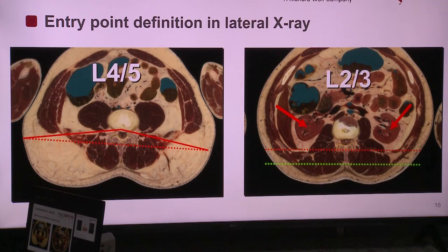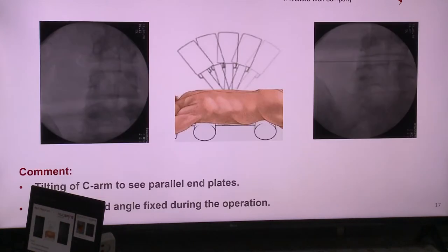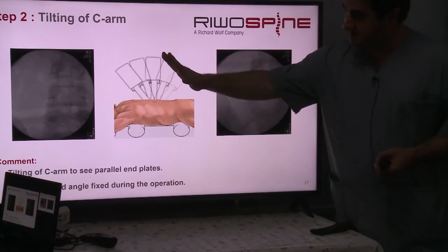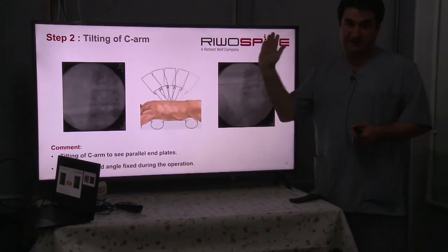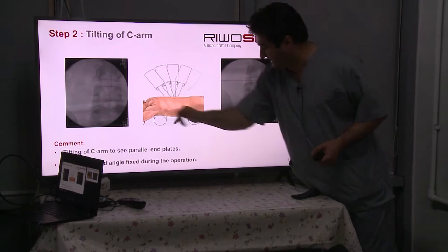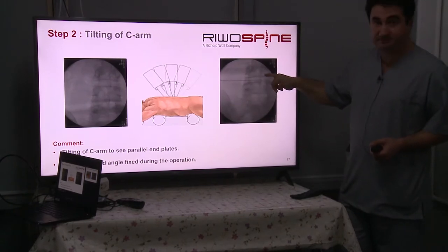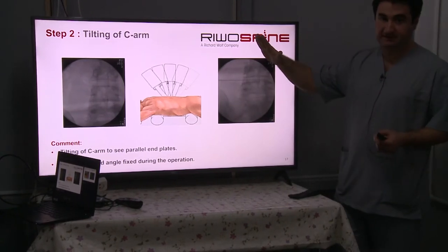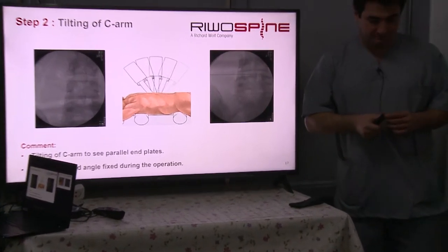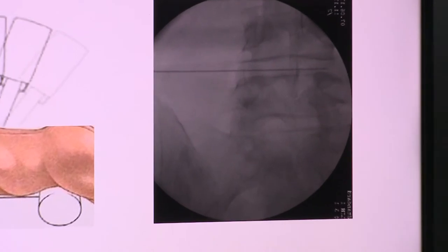No, it's okay. Okay. Then the next step, we define the lines, and the next step we switch to AP view. Then AP view, we change the direction of the angle of the C arm. And then we have to see the end plates parallel, like this, by bending. Yeah? Then we mark the interlaminar window. Sorry, the middle of the disc, yeah.